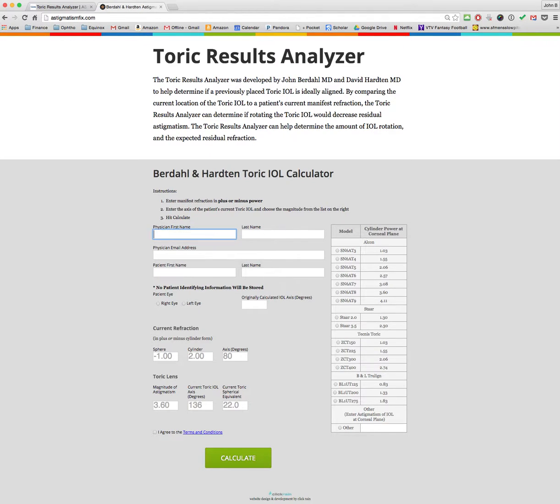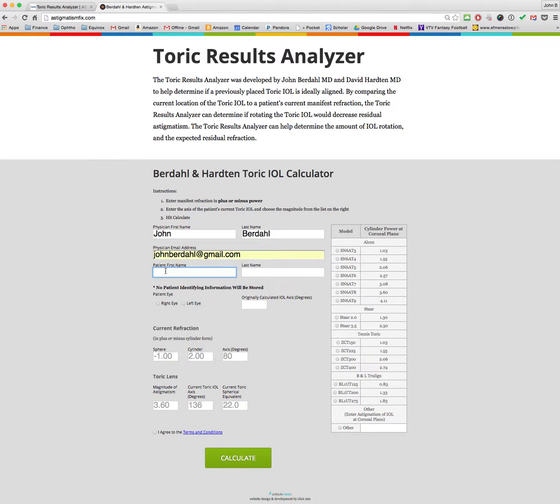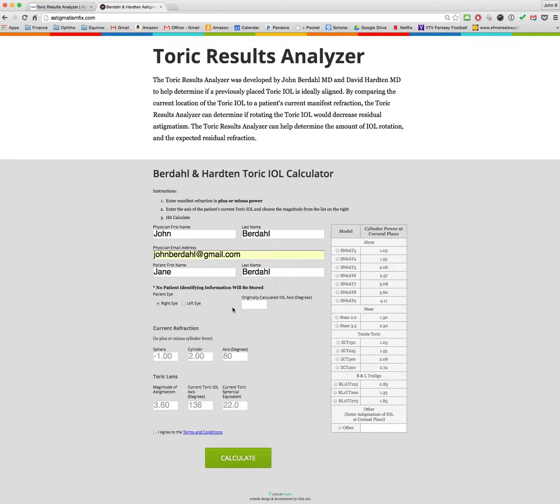You enter your name, your email address, and the patient's name — the patient's name is not recorded and no private health information is kept. Then enter which IOL you're talking about, and the originally calculated IOL axis from whatever formula you used, whether it's the Acusoft calculator or any of the other calculators that are available.